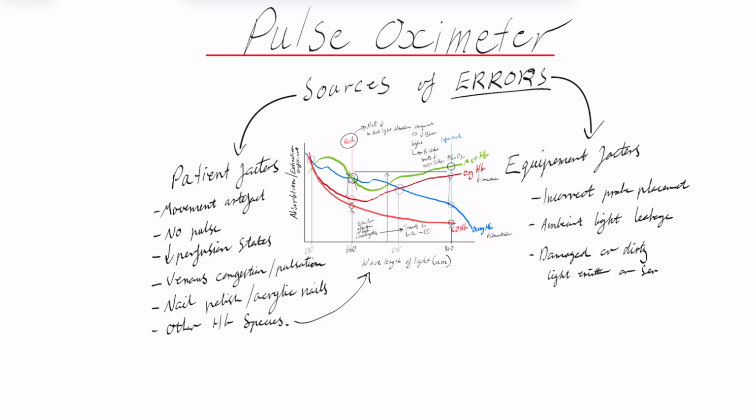Another key thing to talk about with pulse oximetry is that a pulse oximeter tells you about oxygenation, but not ventilation. So a patient can be hypoventilating and accumulating CO2 and becoming acidotic while having perfectly normal SpO2. For example, if we pre-oxygenate someone in theatre, patients can actually maintain normal saturations for minutes despite no breaths at all. And this is further exacerbated by the fact that there is a 20 to 30 second delay before sats will drop. So by the time their apnea has led to a desat, they've probably been low in oxygen for about 20 to 30 seconds.